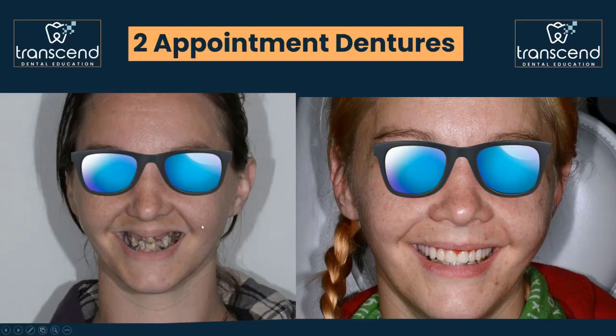So anyways, this is something any dentist can do with or without the facial scanner and can consistently get results like this. And man, if you've got the power to do that in your office, you now have the ability to do some life-changing work that you can do as a charitable type thing like we did here. We didn't charge anything for this because the only cost we really had was a little bit of resin, and then the export and the implants, which Blue Sky Bio was very gracious to donate. They are excellent about helping with charitable type things, so very grateful to them. But again, life-changing dentistry that anyone can learn to do.